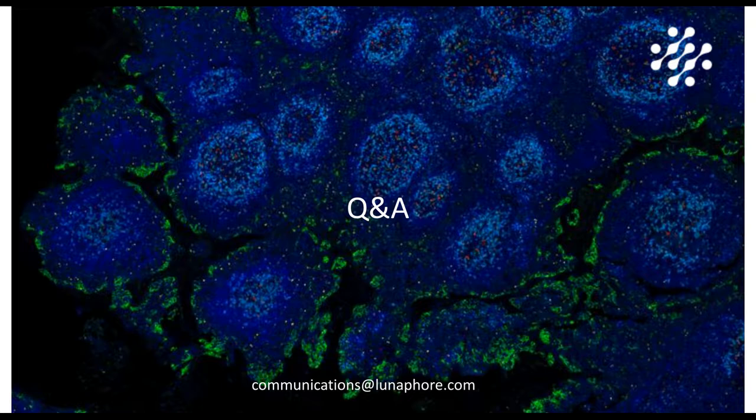But for colocalization analysis, you have to make sure that the assay is correctly optimized, especially regarding crosstalk. So you have to make sure that spectral unmixing is properly done, that you do not get bleed through from other markers or channels. So a good way for that is, beforehand of the optimization, you could make sure to allocate markers that are supposed to colocalize to spectrally distinct fluorophores. That could be a way to go for colocalization analysis.